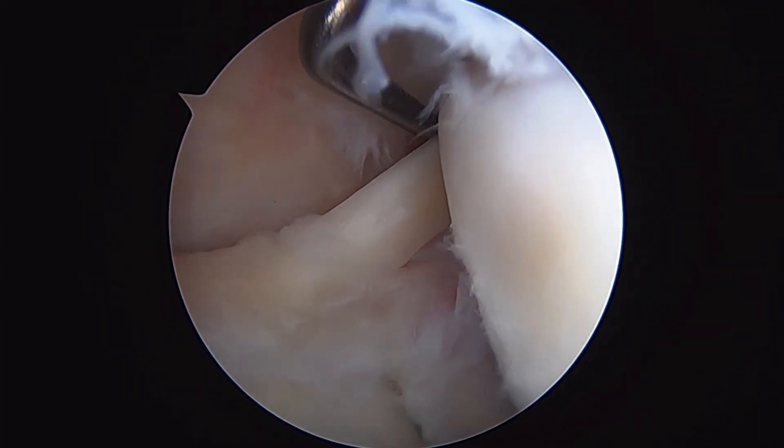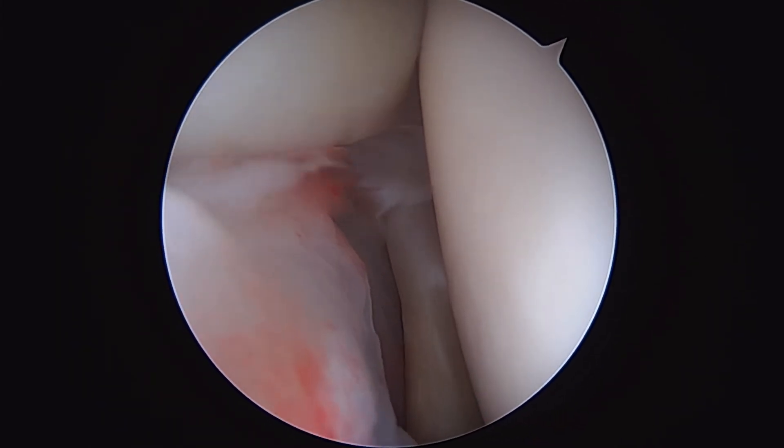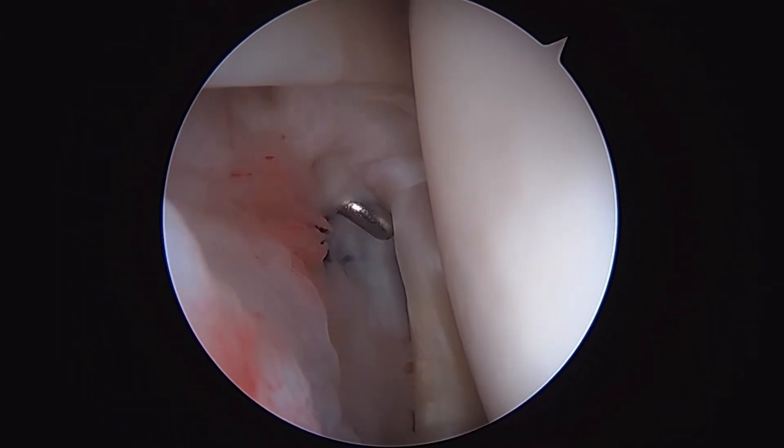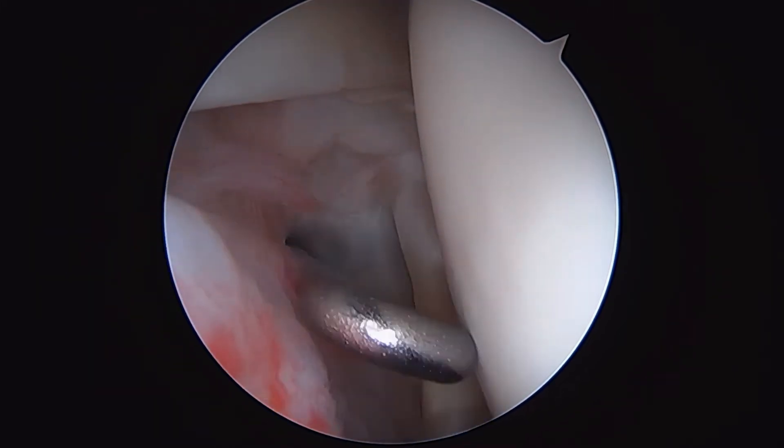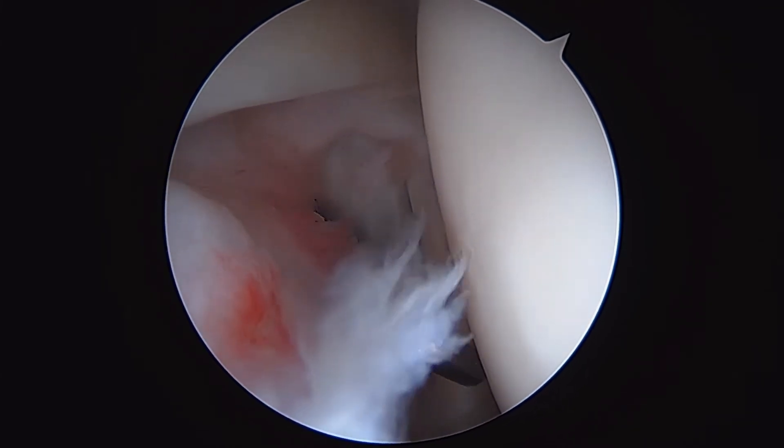If we move our scope through the front of the shoulder, that is the subscapularis tendon right here. And this is the rotator interval through here, sort of below the long-headed biceps and subscapularis.